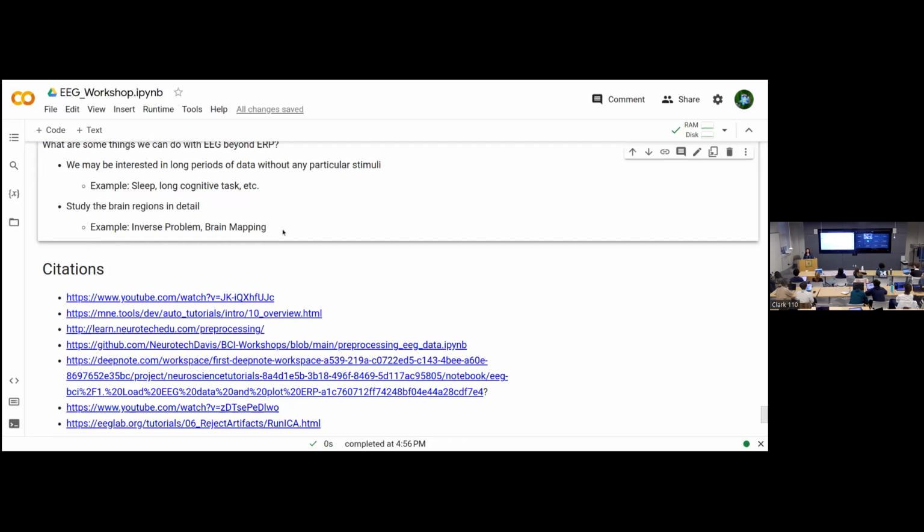So remember how we talked about EEG has good temporal resolution, right? It returns electrical activity corresponding to cognitive events very quickly, but it doesn't exactly tell you regions inside the brain that correspond to the event.